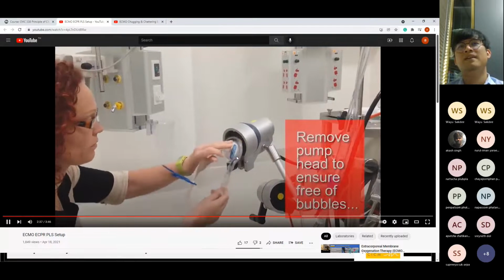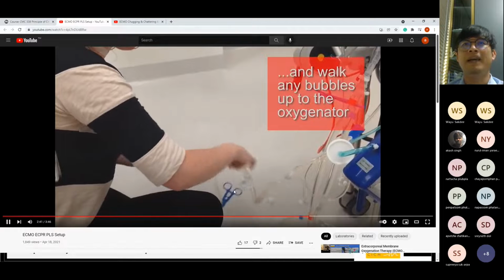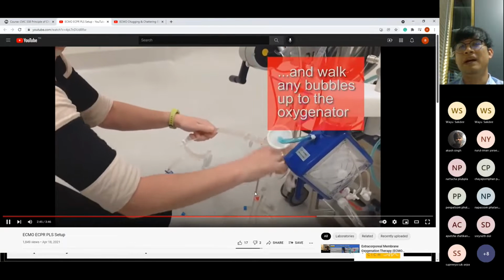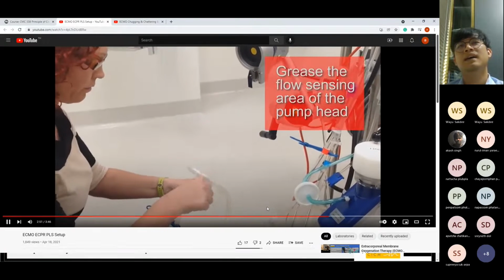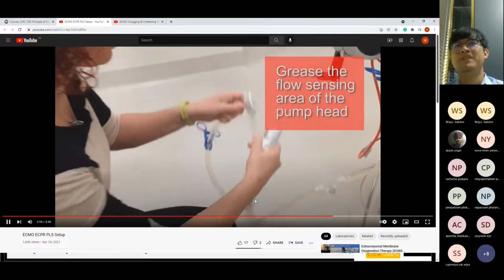You can see now she clamps the blood inlet, right? So no outflow, and now she's going to put gel on the flow probe to measure the flow.